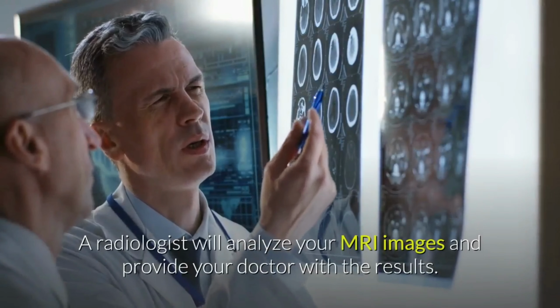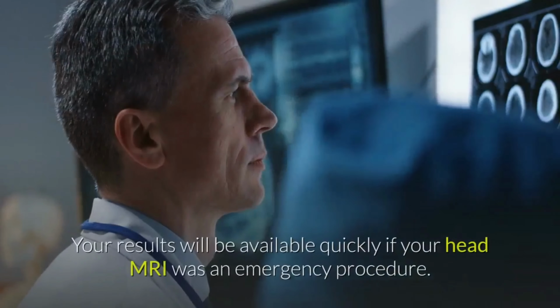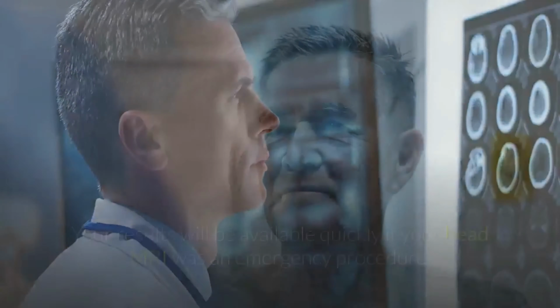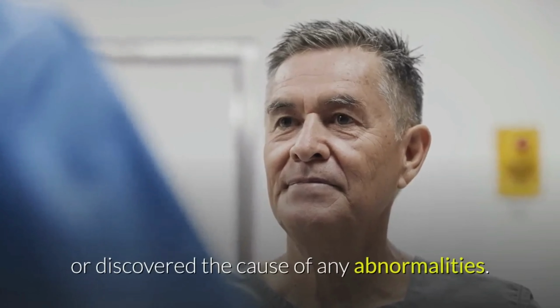A radiologist will analyze your MRI images and provide your doctor with the results. Your results will be available quickly if your head MRI was an emergency procedure. Next steps will depend on whether the results revealed anything unusual or discovered the cause of any abnormalities.